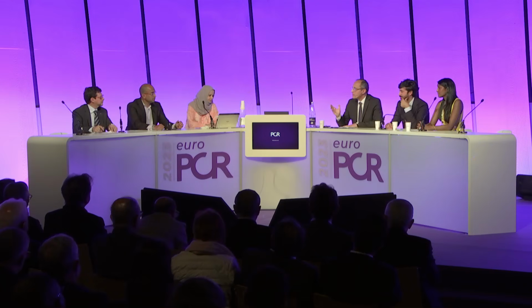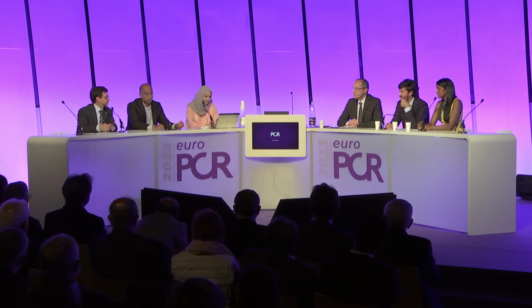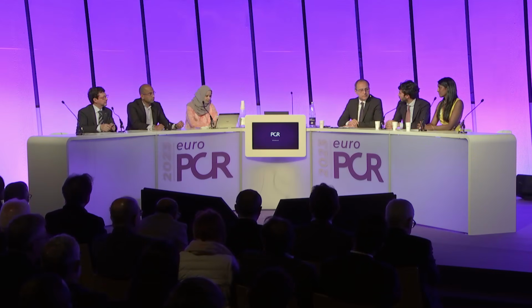Are there questions from the chat before we move on? I think a question that we haven't addressed yet is about, if you're going to do it in the right coronary, using pacemakers or aminophylline. Who wants to take this one? Right coronary artery or dominant circumflex, need a pacemaker? Well, generally, no. It's very unusual circumstances, and you can fix this with a dose of atropine. It's very difficult that you need to pace for a long time. I think aminophylline in the flushing bag could also be a solution in these cases, and we are not using the pacemaker anymore.